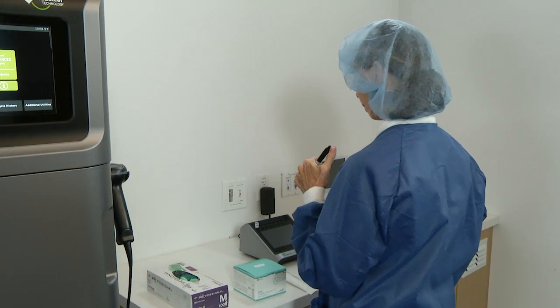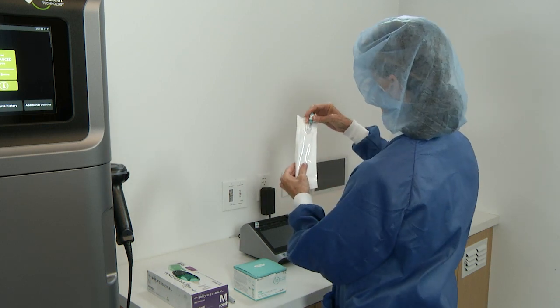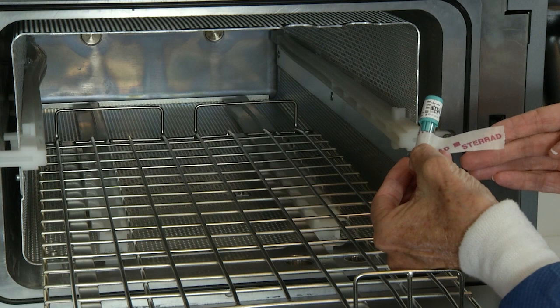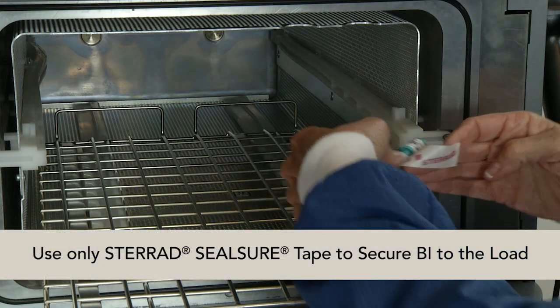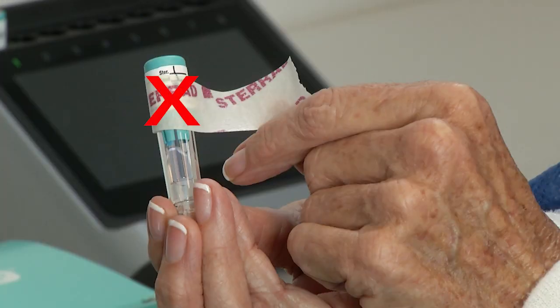When preparing a STERAD Velocity Biological Indicator to monitor a sterilization cycle, do not place it in a peel pouch. If you're applying tape to secure the biological indicator to the shelf, use only STERAD Sealshure tape. As a reminder, do not apply tape or labels to the BI cap prior to processing in the STERAD sterilization systems, as the tape will block the sterilant ingress windows, causing misleading results.